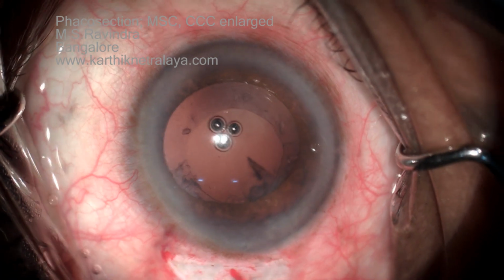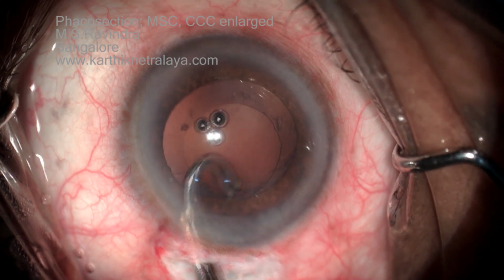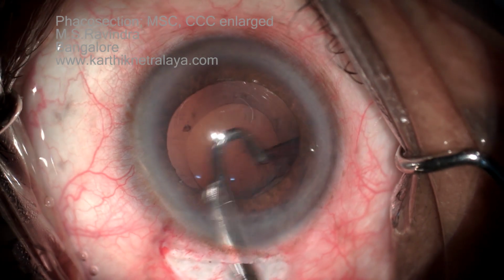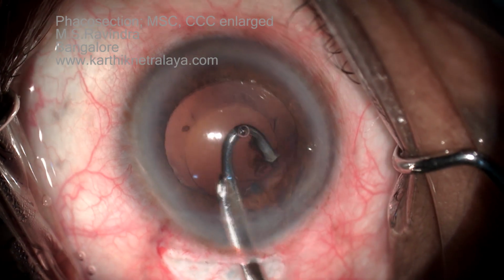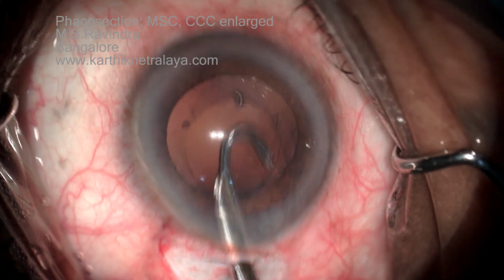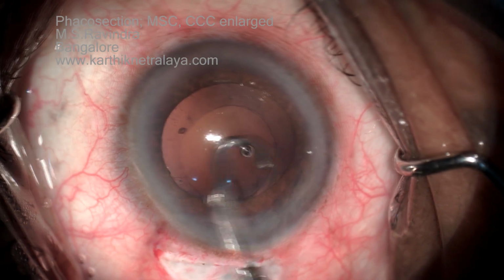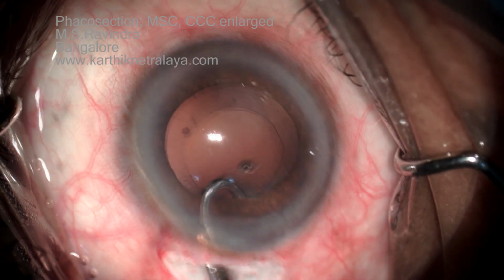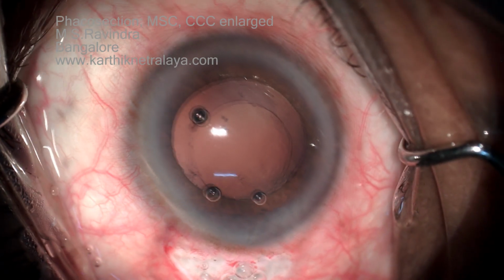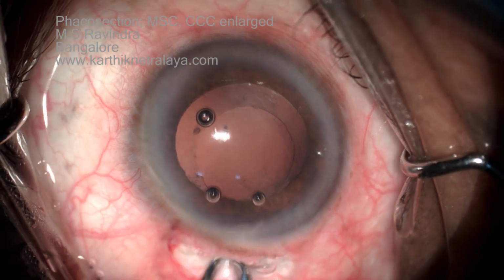There is a single tunnel which is 6 mm long and it's self-sealing. It's not dilated or distorted during the nuclear extraction. It's a cold technique. The anterior chamber remains normal throughout. It is not deepened like in other techniques where positive pressure is involved. The endothelium is maximally protected in this technique.